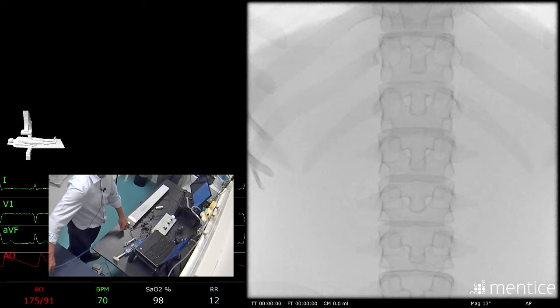So through our 6 French sheath now, we're advancing a wire and a multi-purpose catheter. That's a catheter with an angulation at the end of it, so that could be a hockey stick or a Compi catheter, which are commonly used. And these are end-hole catheters through which we're passing a curved hydrophilic wire.